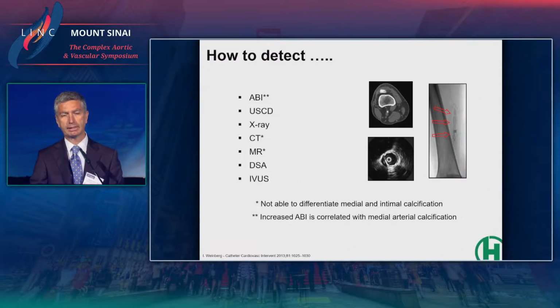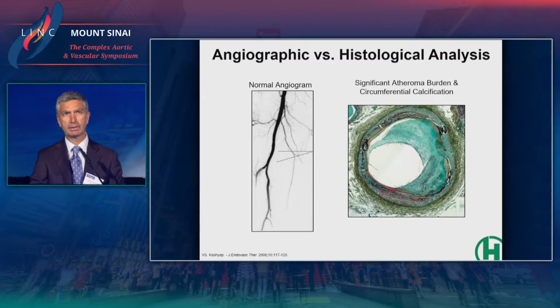Well, how can we detect a calcification? Obviously, you can see we can use different diagnostic methods, but what is important is that the majority of them are not able to make a difference between the medial and the intimal calcification. And we know that from a therapeutic point of view, this is very important. Just to give you an idea, angio, this is what we generally use in our cath lab, but you can see that this is the same patient, same level.